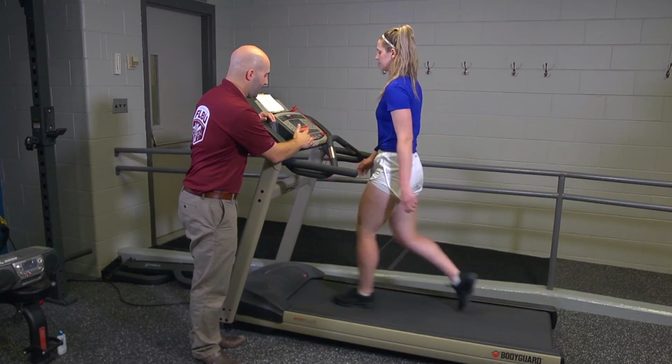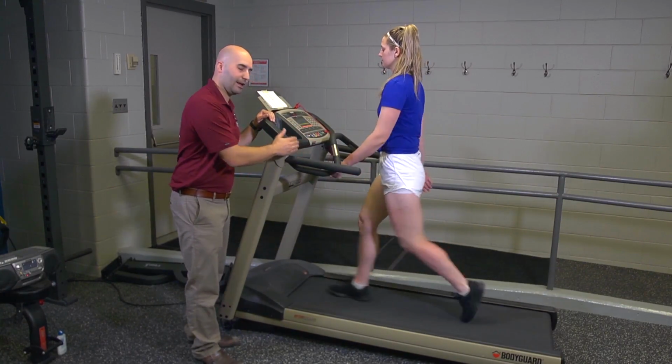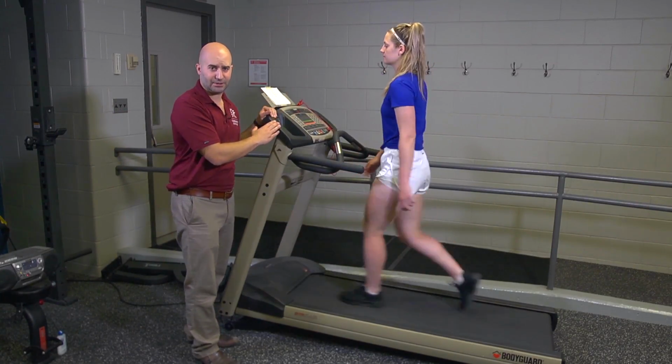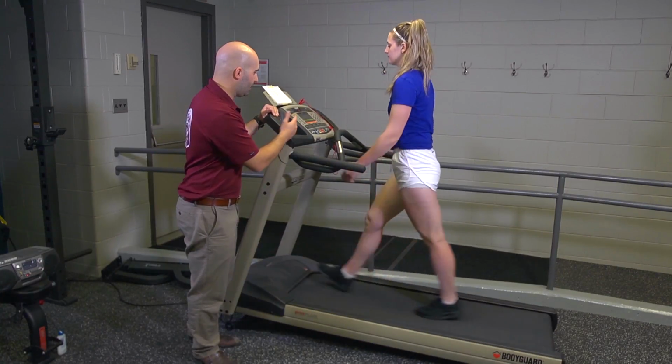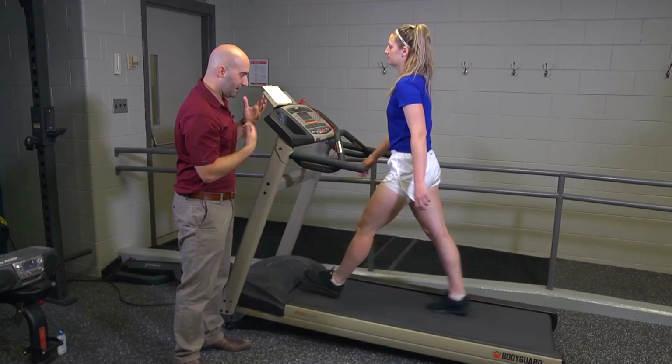So you're going to add 5% slope, let your client know ahead of time. All right? And at the end of that warm-up load, you'd also be asking the rate of perceived exertion on a scale of 6 to 20, how they feel. And now she would do another 4 minutes at that speed. All right? Once again, client contact.